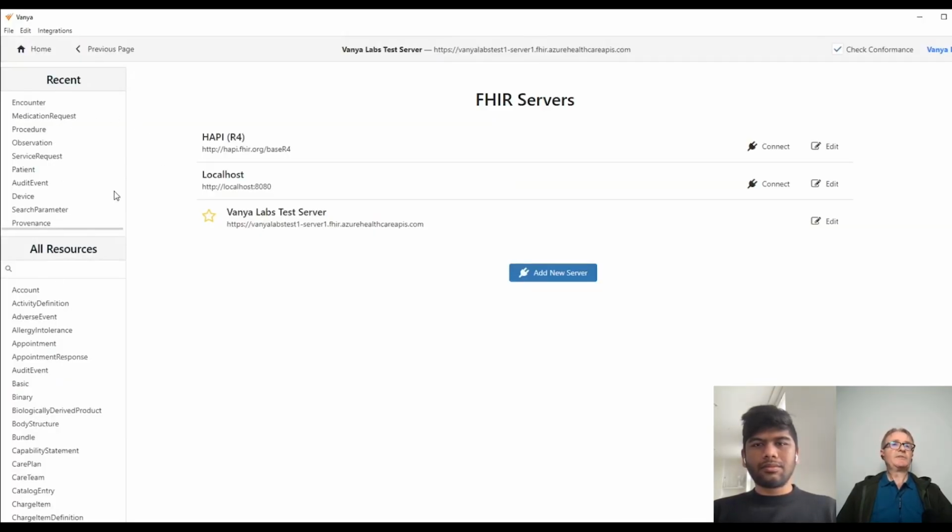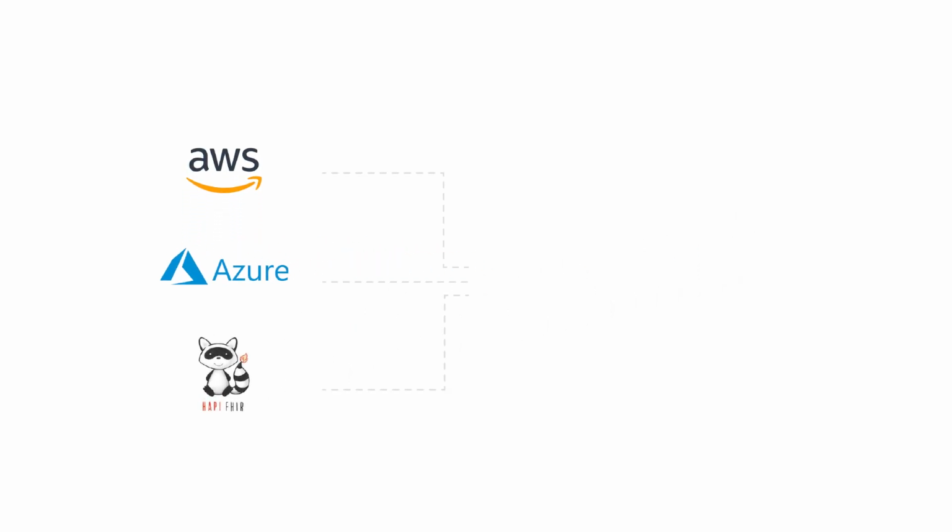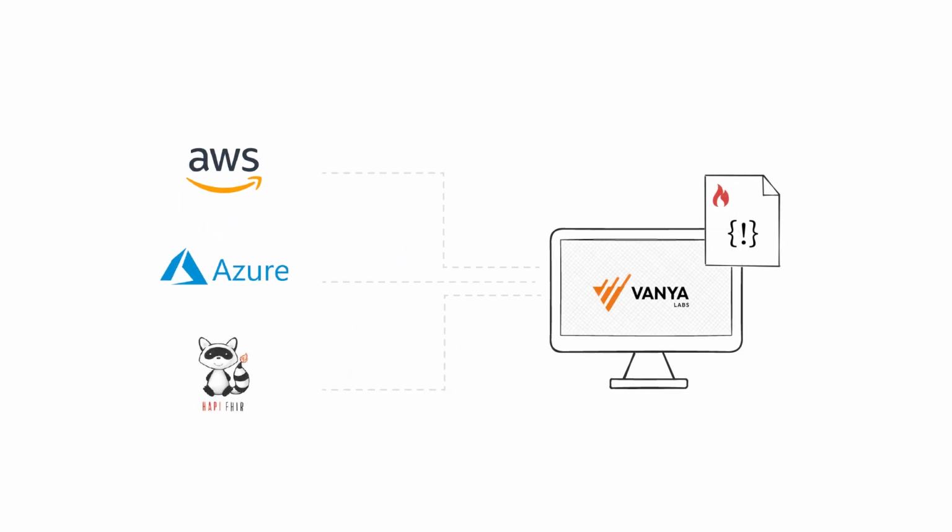So I put this in because my experience on different projects was that most teams will be working on only a small subset of FHIR resources. They might use 10 or 15 throughout the project and maybe 5 or 6 over the course of a day or a week or a sprint and so on. So again, Vanya is a very lightweight application, a standalone desktop app that connects to any FHIR server, be it AWS HealthLake or Azure or even your own HAPI FHIR, and it will show you all the resources that are available on the server.